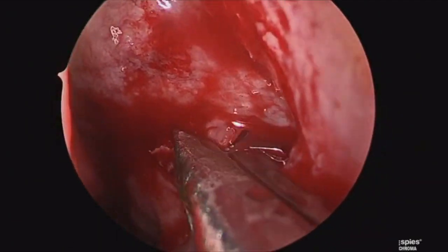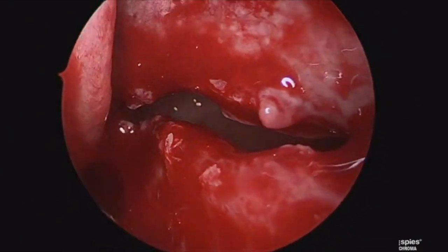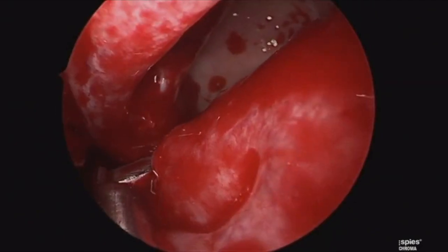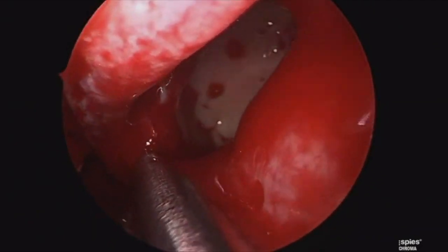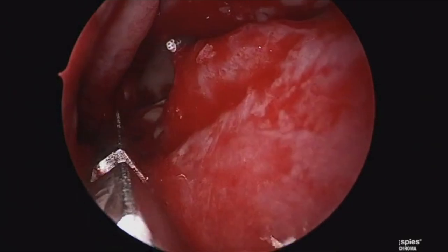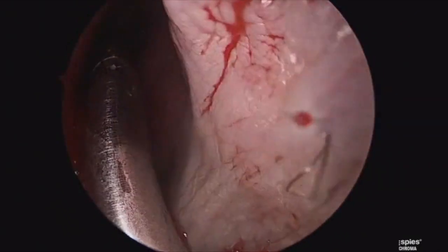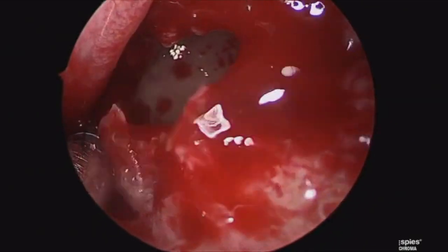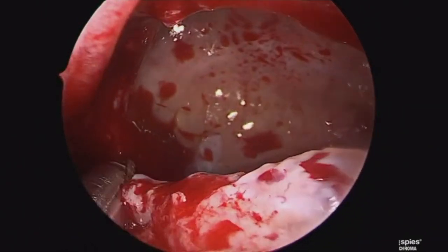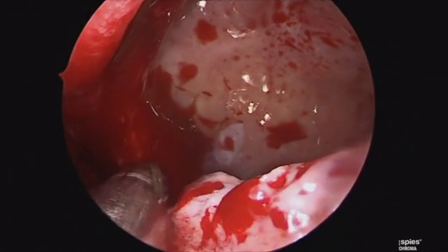In general, I take this back very close to the posterior wall of the maxillary sinus. We'll then use a right-going Stomberger downward punch to bring this down towards the shoulder of the inferior turbinate. Then we'll come in with an adult backbiter, taking that from that inferior incision made with the Stomberger down punch back towards the natural ostium. It's important to curve this upward as you come towards the natural ostium in order to remove the intervening portions of that medial wall of the maxillary sinus. After it's been loosened, we'll trim that with a 40-degree microdebrider.